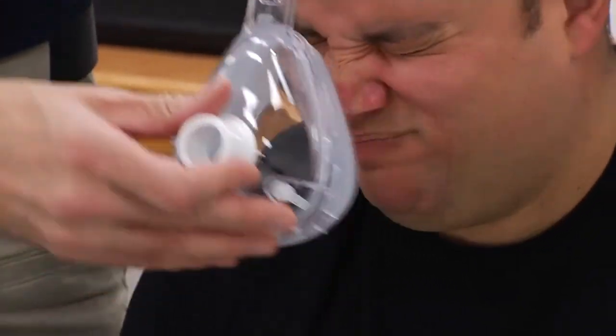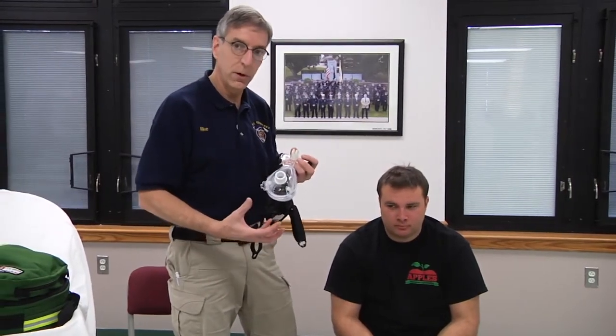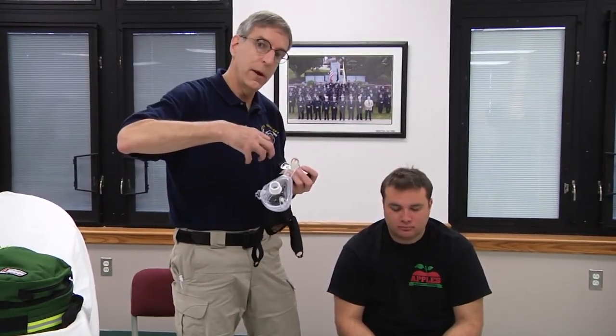we're actually getting a flow probably somewhere around 160 liters per minute coming through here, which is pulling atmospheric air in and not giving us 100% oxygen concentration. In fact, we're probably only getting about 30% oxygen concentration. And while somebody with some significant respiratory distress might improve with the pressure that's being applied, they could need more oxygen. So your option for administering oxygen in that setting, in addition to what's coming through the CPAP, would be to put a cannula on the patient.